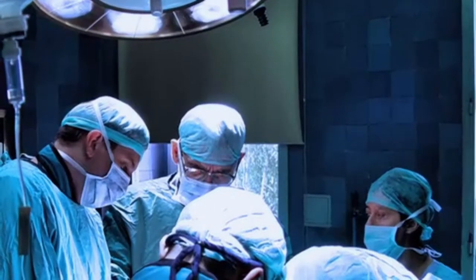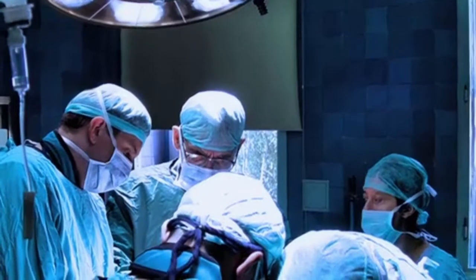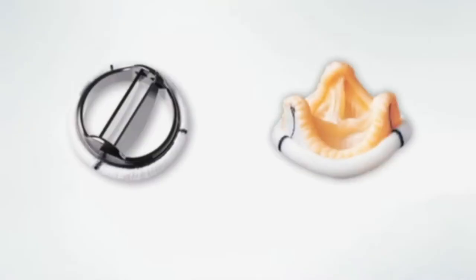If the surgeon cannot repair your heart valve, it will be removed and the surgeon will implant an artificial or prosthetic valve in its place. There are two types of prosthetic valves: mechanical and tissue.